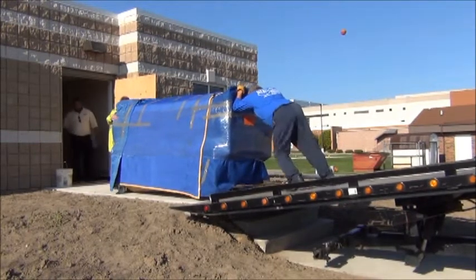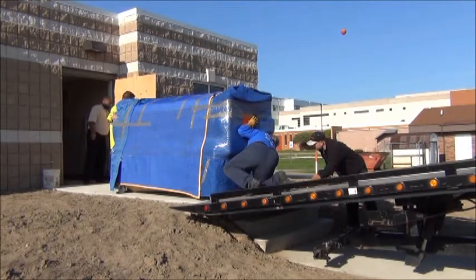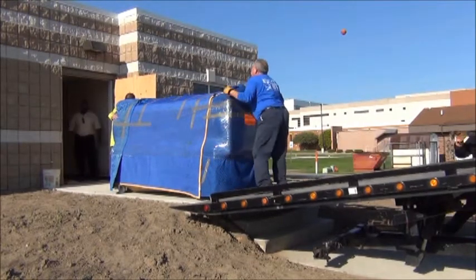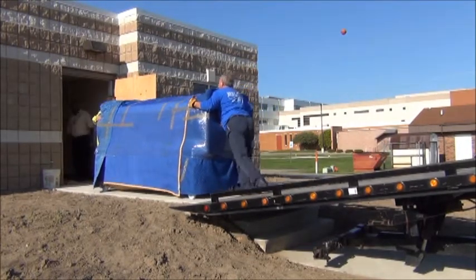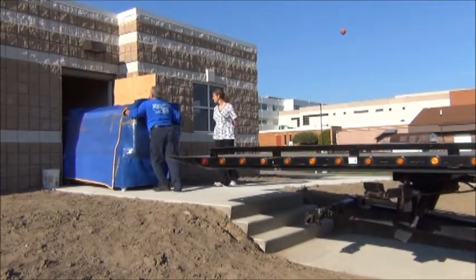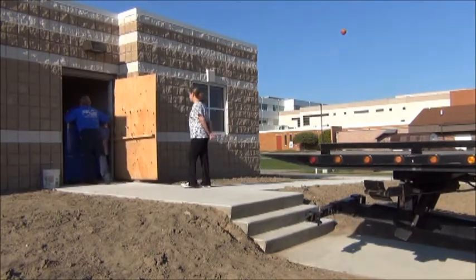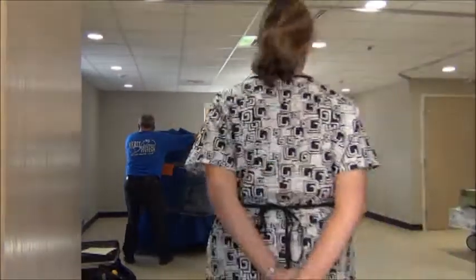The Hyperbaric Center will follow already established Medicare guidelines for the treatment of certain conditions that have been empirically proven to be improved by this type of hyperbaric treatment. Other insurance providers such as Blue Cross Blue Shield also allow for this kind of treatment. Despite being a long-established medical practice, there are a few risks associated with being immersed in a pure oxygenated atmosphere.